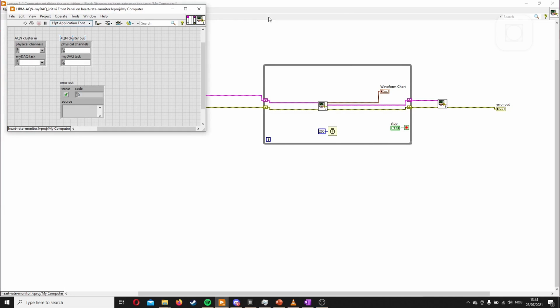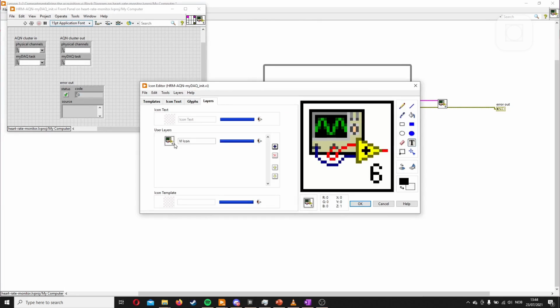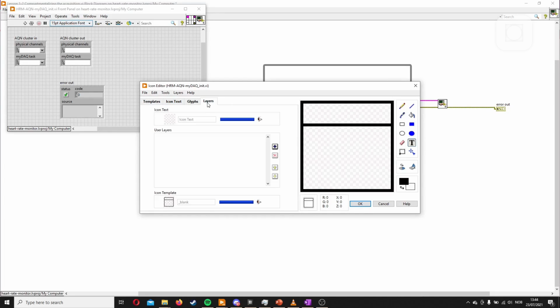Save. We also want another icon, as this is boring, or it doesn't really explain what it is. It gets confusing when you make larger VIs. So, then we change to white here. You can change any color. I choose white because I want this as the background. I'll fill it here. I'll switch back to black.